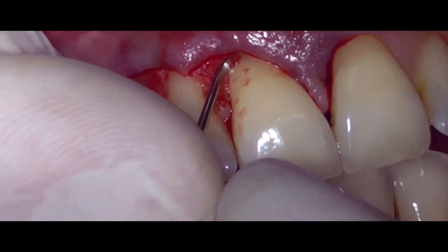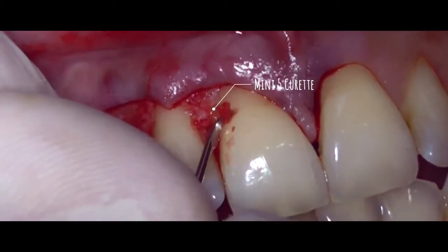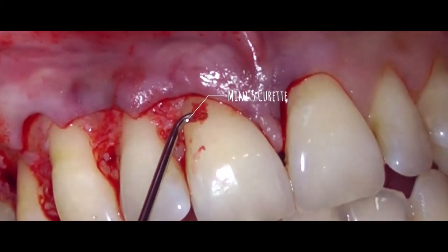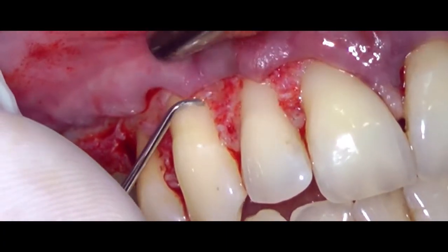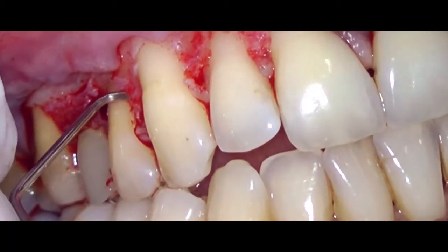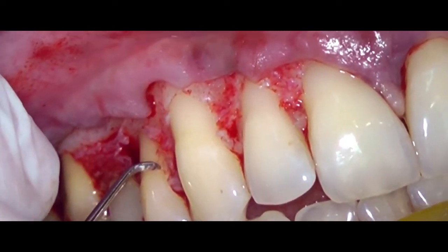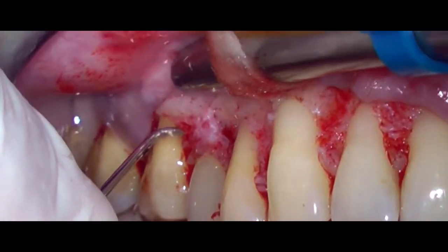You can see me now scaling the root surfaces. We use mini 5 curettes and attempt to keep the scaling limited to the area of the root that has been previously exposed. We don't want any damage to the precious connective tissue fibers that insert to the root cementum.